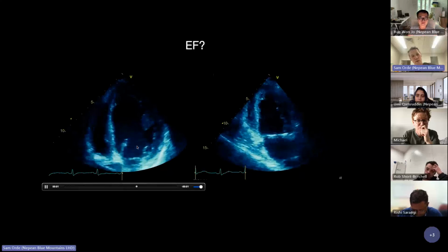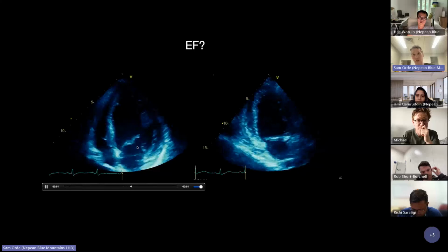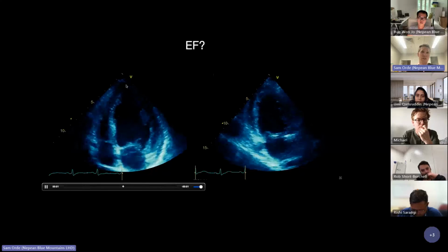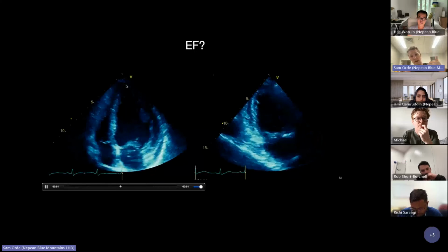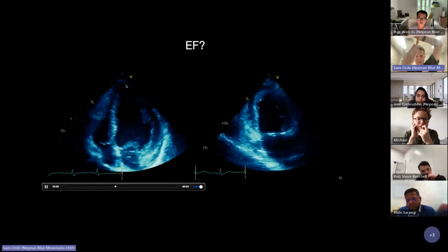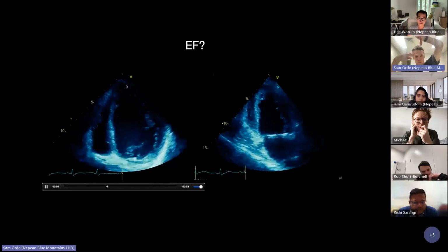If you are imaging correctly, the apex should not move. It should thicken, but it should not move. Imagine my thumb is at the top of the picture, and the apex should stay fixed to that point, and the base moves up and down towards it.